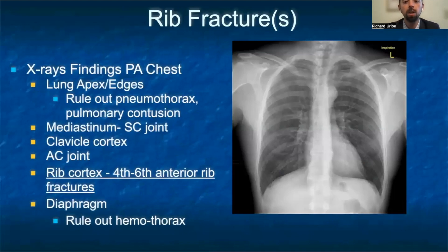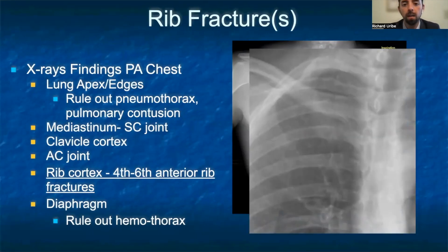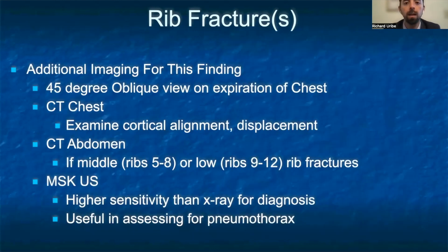The first imaging you may obtain with rib fractures is the PA view of the chest. When we examine this x-ray, we see that there are cortical discontinuities in the anterior portion of the fourth, fifth, and sixth ribs, but no displacement. Rib fractures are often not seen on a PA view of the chest and may require a 45-degree oblique view on expiration to best diagnose.